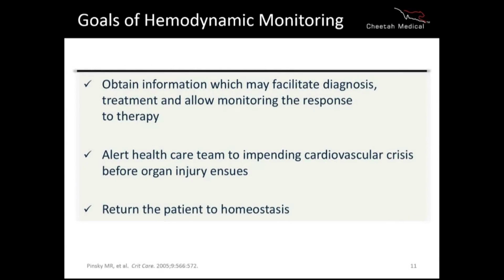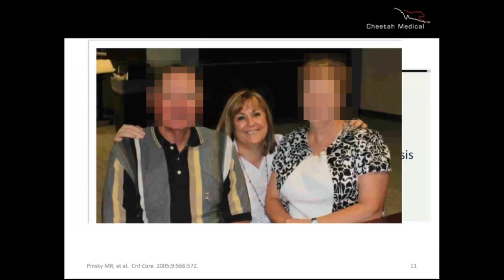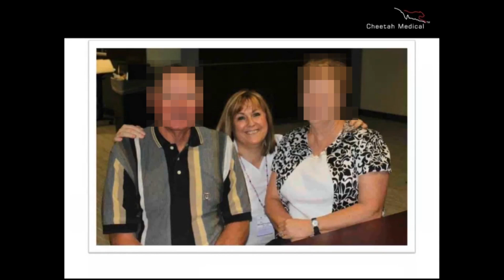The goals of hemodynamic monitoring is to obtain information which may facilitate diagnosis, treatment, and allow monitoring the response to the therapy. It also helps alert the healthcare team to impending cardiovascular crisis before organ damage takes place. And it can also help you to stabilize that patient faster. I would like to introduce you to a very special patient of mine where the Cheetah NICOM and hemodynamic monitoring really did a big impact on his hospital course. And we'll talk about him a little bit later in the presentation.